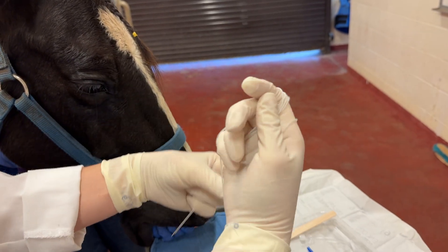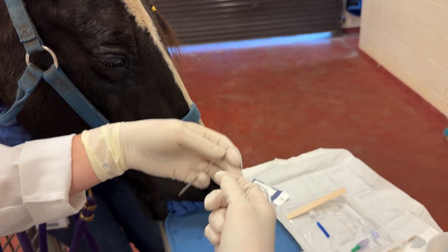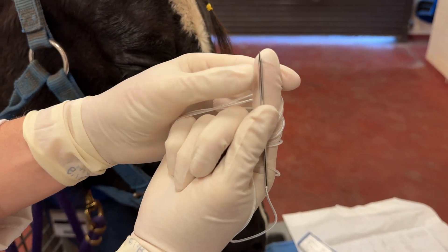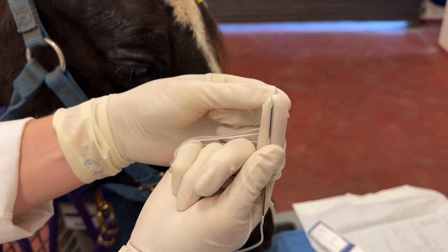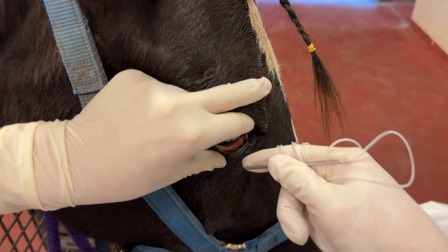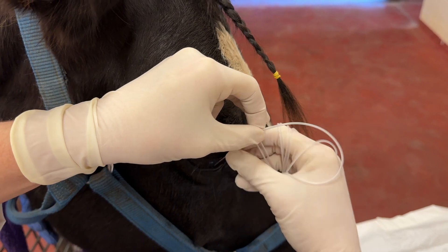You're going to guard and protect the eye from this trocar by placing it along your index finger, making sure that the tip of it is right at the tip of your finger, so that when you first go touch the conjunctival fornix your finger is the first thing to touch. Then you're going to place your finger down into the lower conjunctival fornix and feel for the orbital bone.